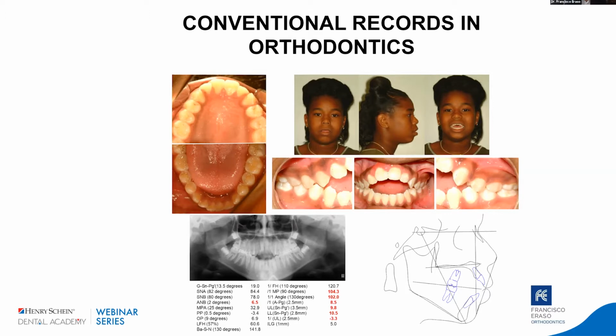The reason is very simple. You have to subtract, you have to segment, you have to squeeze as much information as you can from the diagnostic data. So when somebody asks me, am I going to give too much radiation to my patient? If you are going to produce panoramic pictures or lateral ceph pictures in addition to the 3D data, yes, definitely, you are overexposing the patient.